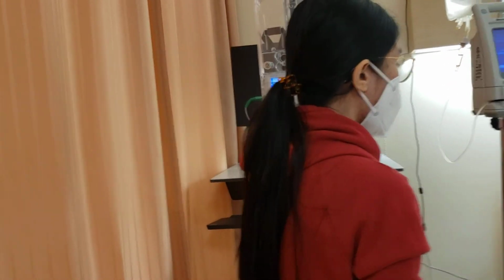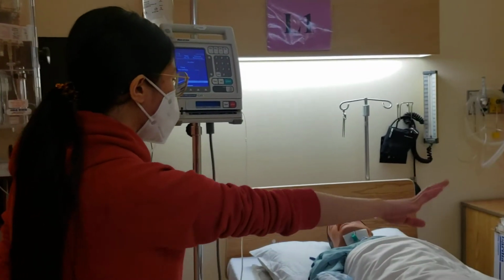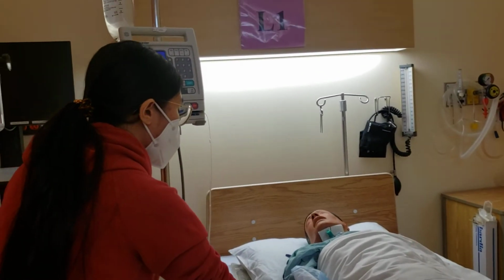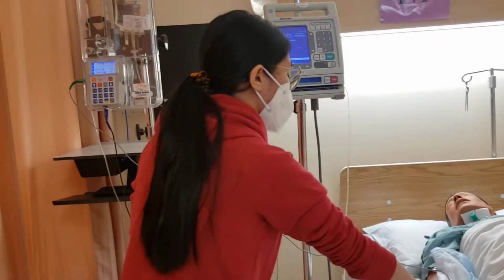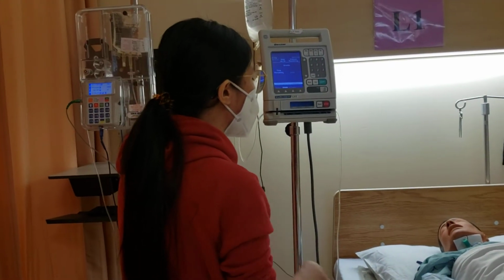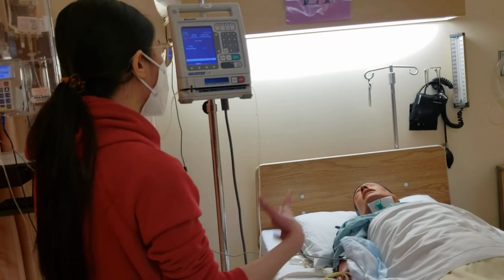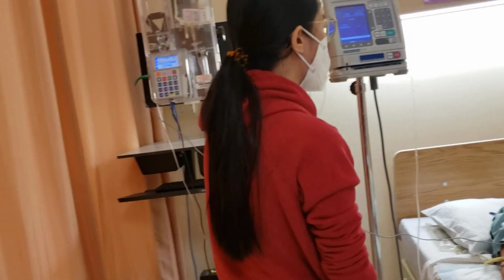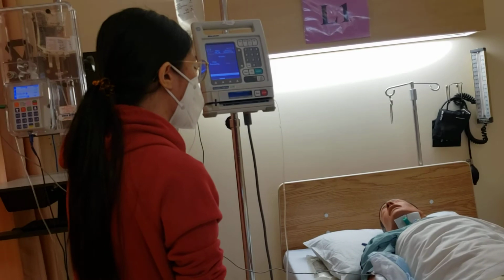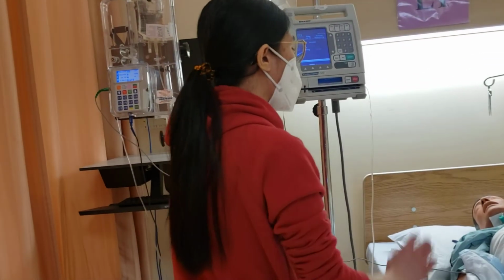once the patient has clicked your PCA button. So, Mr. Tyson, if you have any concerns, you can use the call bell on the other side of your bed. And once again, you have this button for your PCA for you to use. If you have any pain, you can just use this to click, and you just have to wait for that beep. Once you hear that beep, it means that the medication is infusing, and you have to wait for another 5 minutes or so to get another dose of that. And once again, if you have any unusual reaction, you can call me so that I could stop the PCA and we could check on what's happening with you.